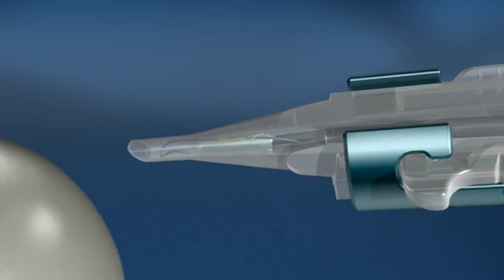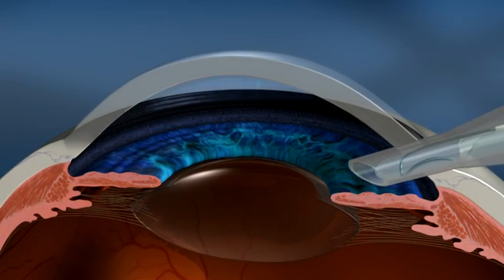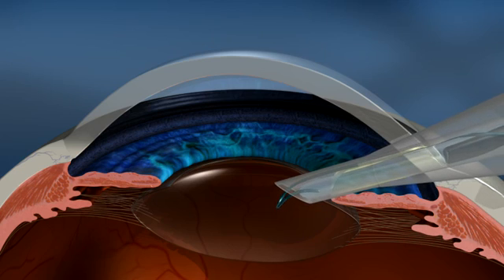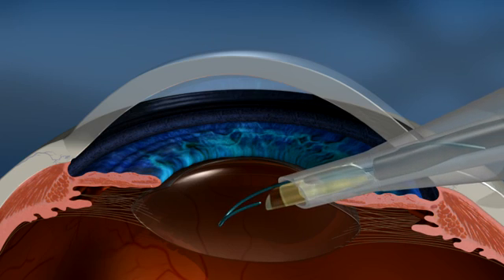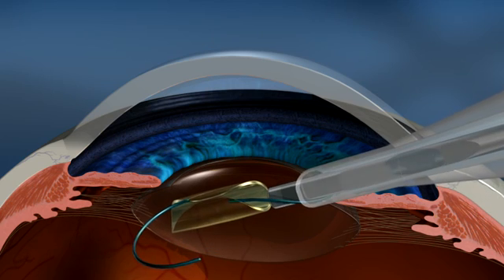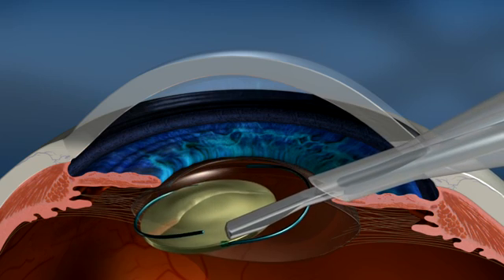For implantation of the Acrosoft multi-piece lens, the surgeon should then position the nozzle of the cartridge through the incision and into the eye. Once the nozzle is positioned within the eye, the surgeon will resume advancement of the multi-piece lens through the cartridge, ensuring that the leading and trailing haptics emerge from the nozzle tip of the cartridge in the desired orientation.